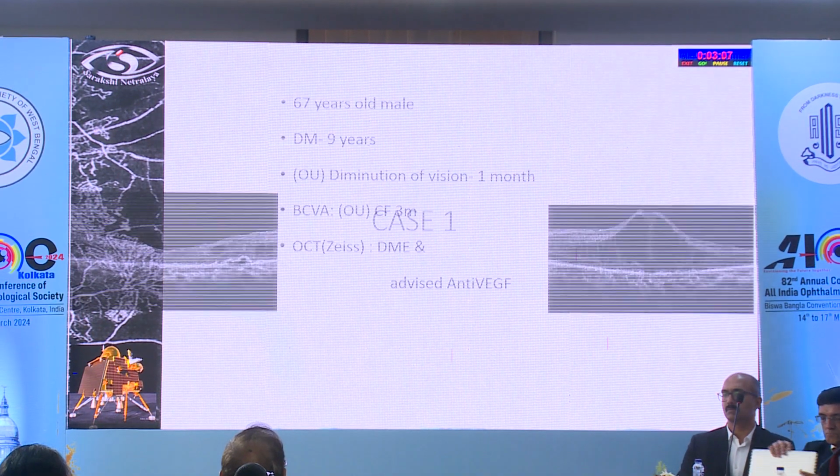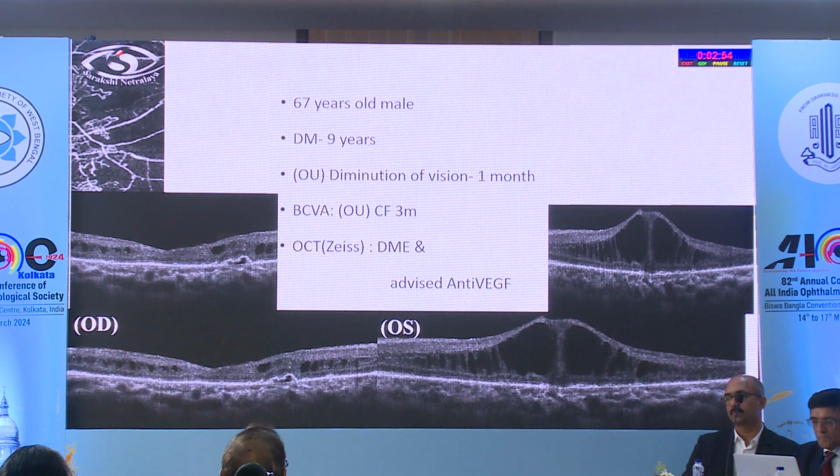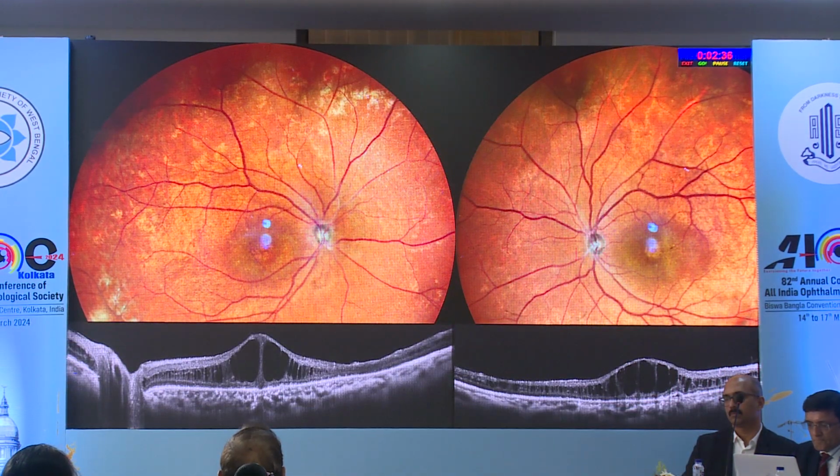Now this is another case, a 67-year-old male who was advised to have treatment for diabetic macular edema. He was a diabetic patient. He was diagnosed elsewhere as diabetic macular edema and was advised anti-VEGFs. Well, when we did a Widefield OCT, our way of looking at the disease changed, as I could see the schitic cavities, in both the eyes, extending quite into the periphery. So it was not just simple diabetic macular edema, but this was a case of macular edema along with a retinoschisis in a diabetic.